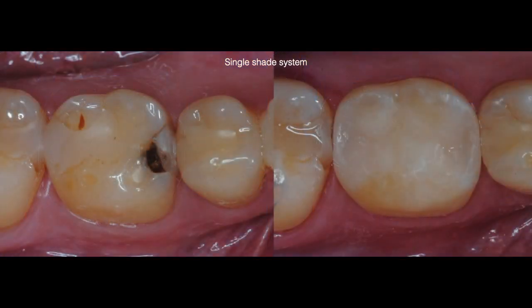Here are the before and after photos where we can observe a slightly lighter appearance of the restorative material when compared to the actual tooth structure, kind of like when you use an A1 shade. Personally I think it is an acceptable match. It is important for me to say that both teeth 29 and 31 were restored as well at a later appointment due to obvious reasons.